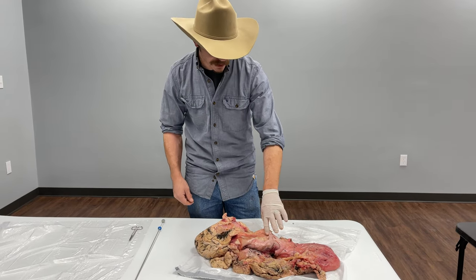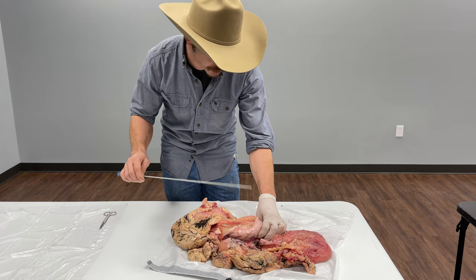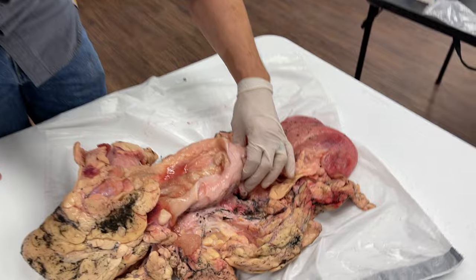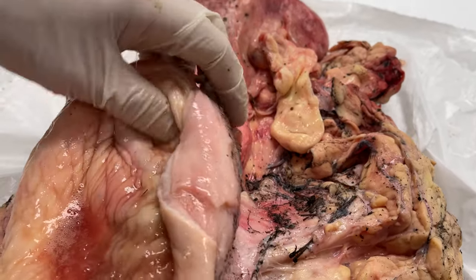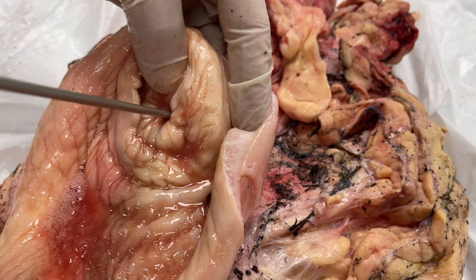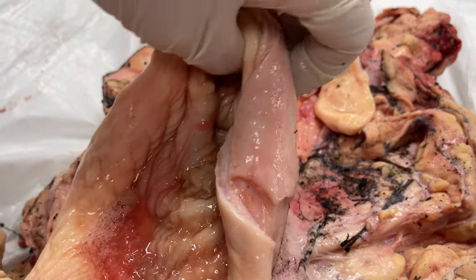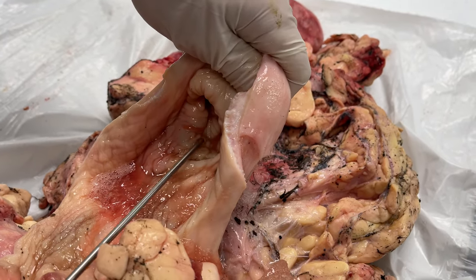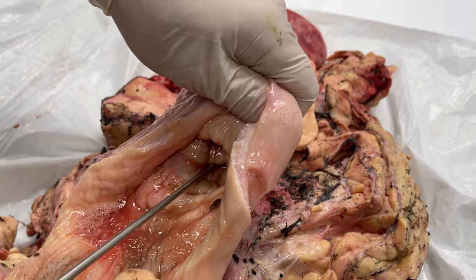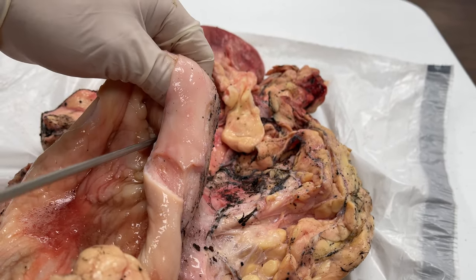Another thing I wanted to show about these tracks is that the end of the cervix is actually kind of rounded out. I've cut back the vaginal canal here so you can see that the end of the cervix rounds outward to the hole, and the hole you put the rod through is in the center. When that rod comes to that, it's very easy to go to the side and get the rod stuck there instead of up in the hole. This is where a lot of people struggle when artificially breeding for the first time — you have to find the center of that cervix.